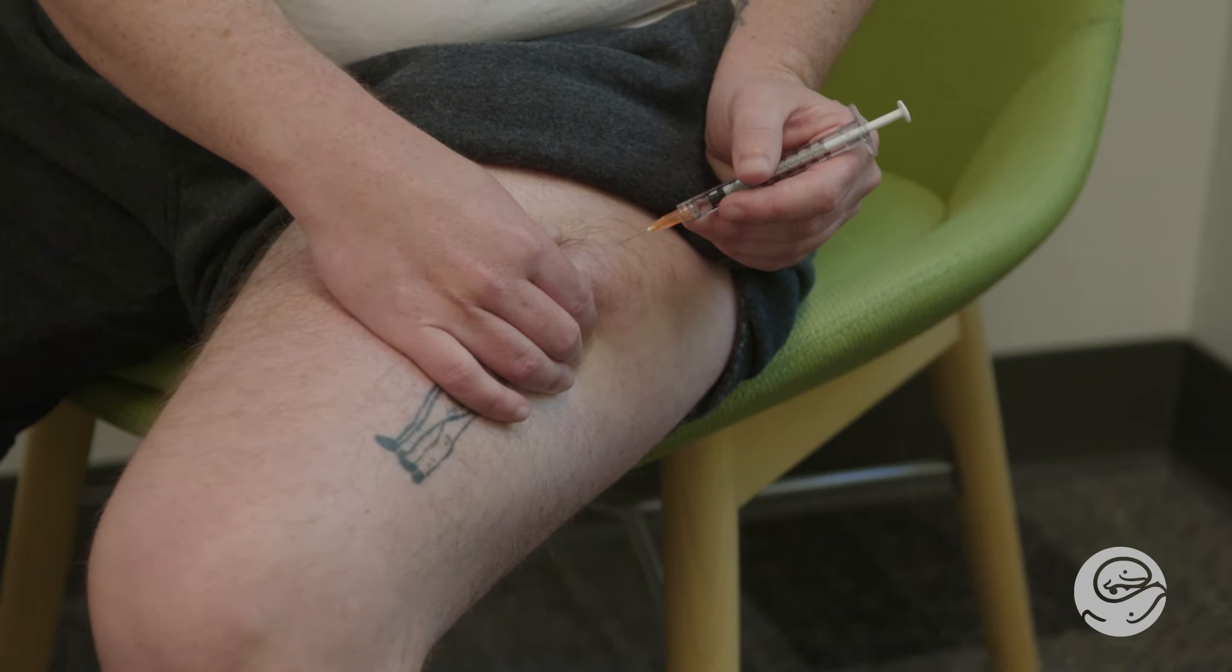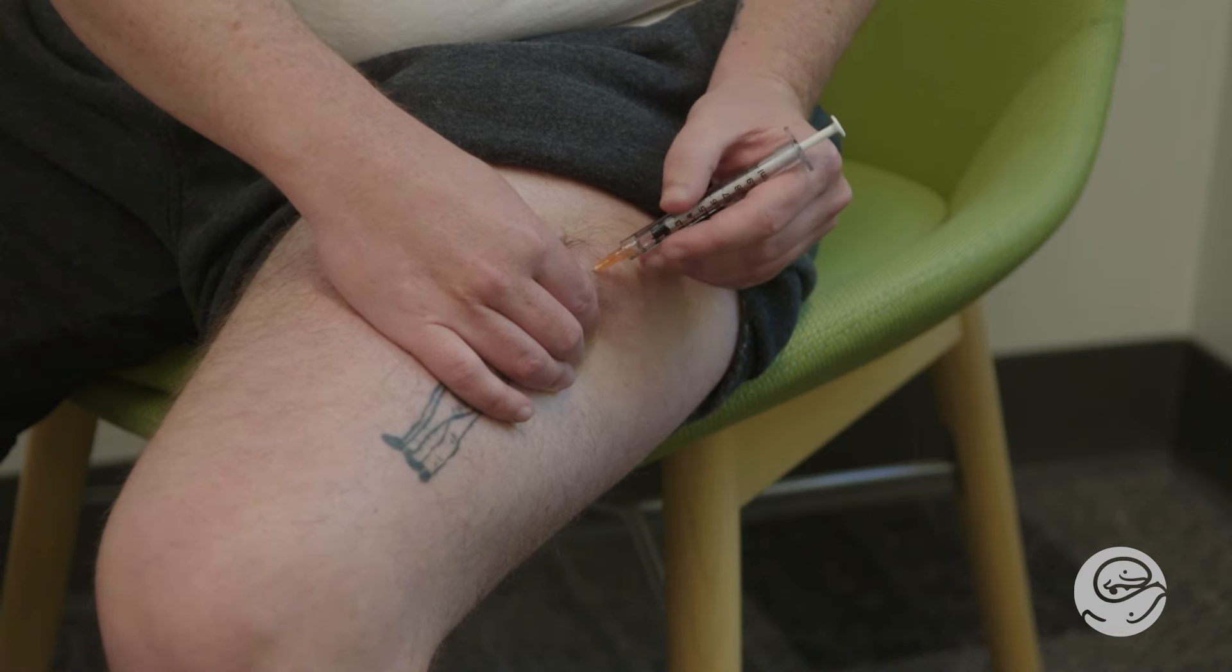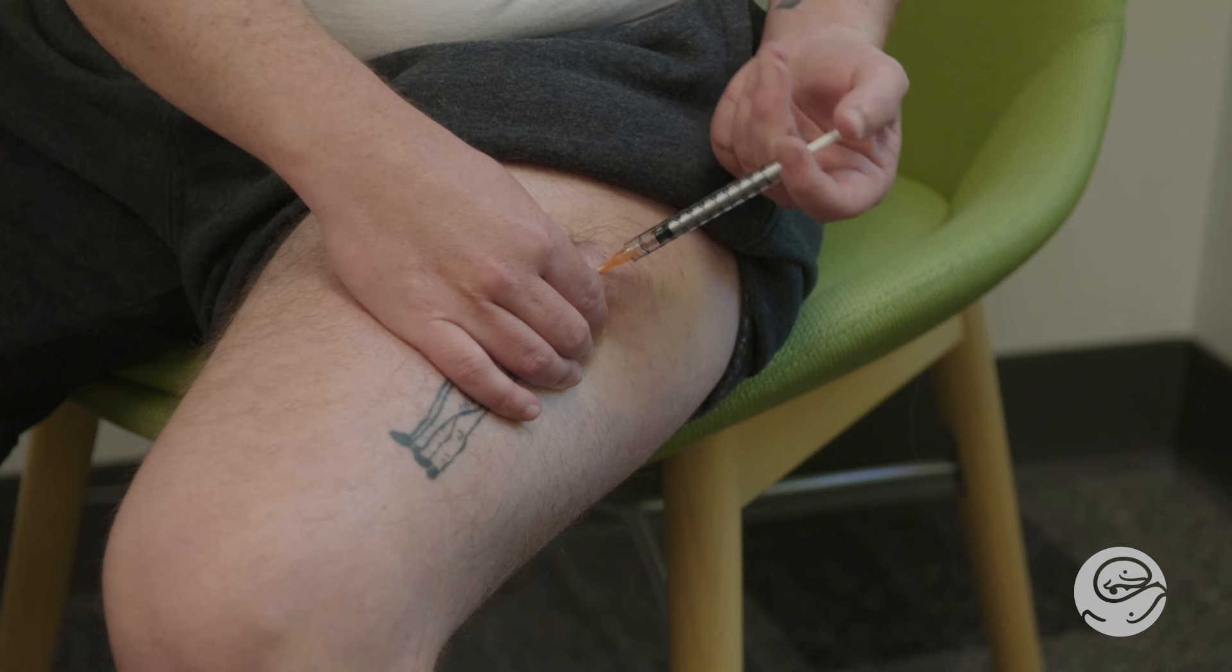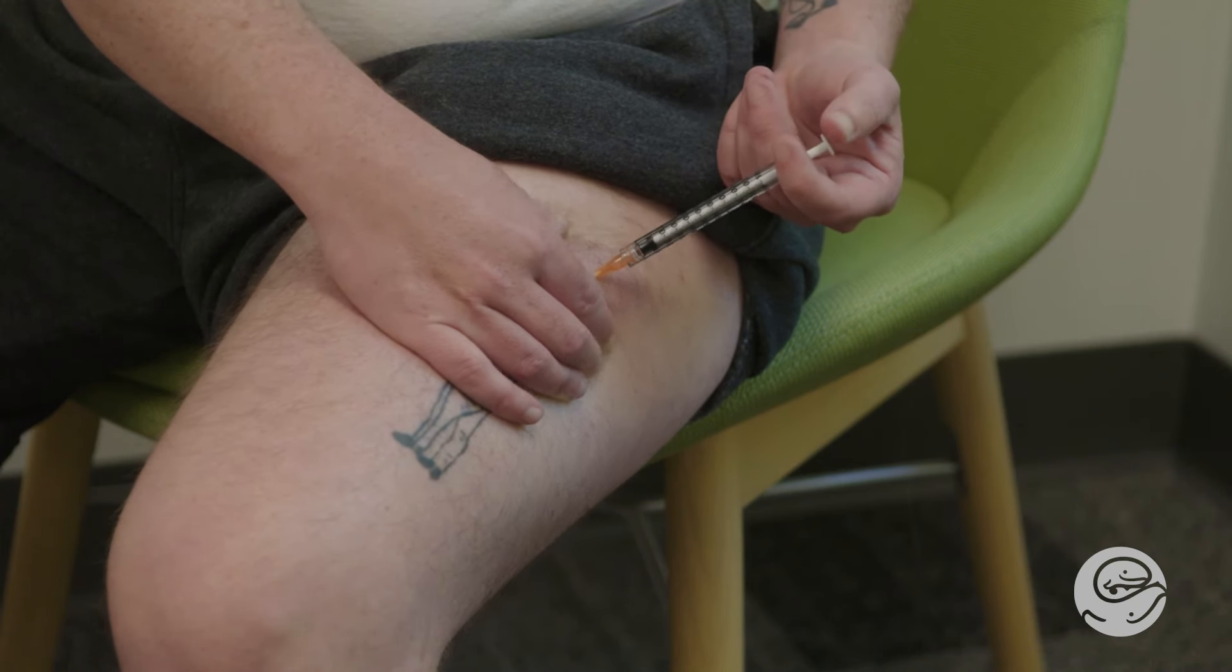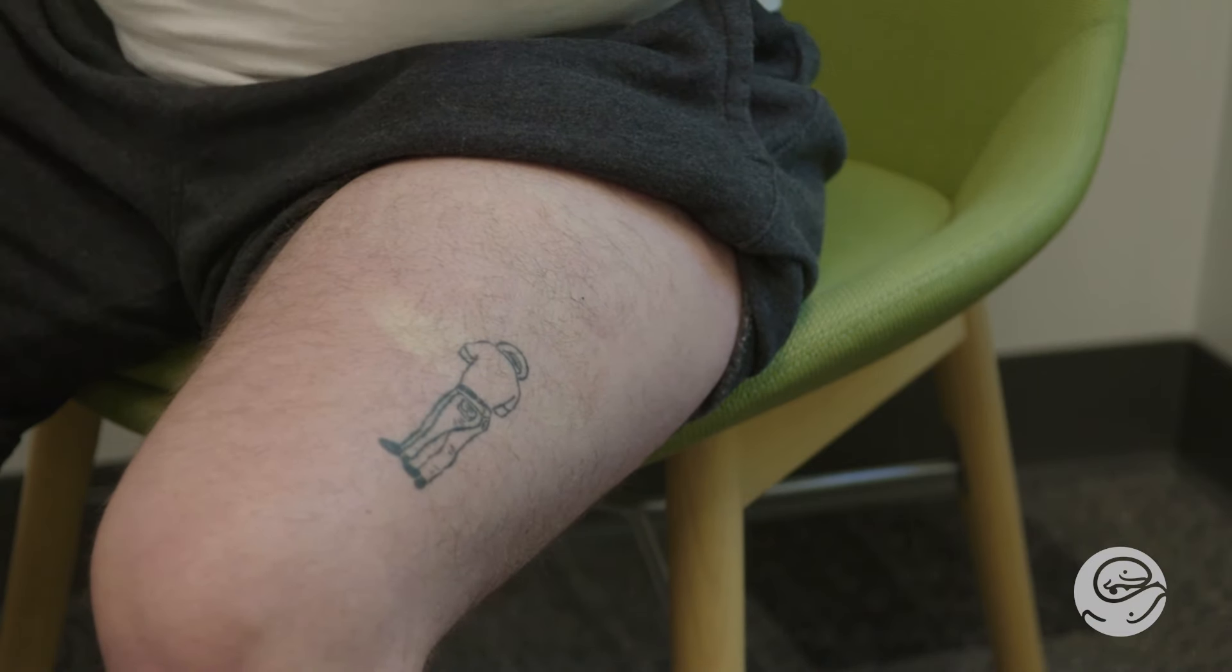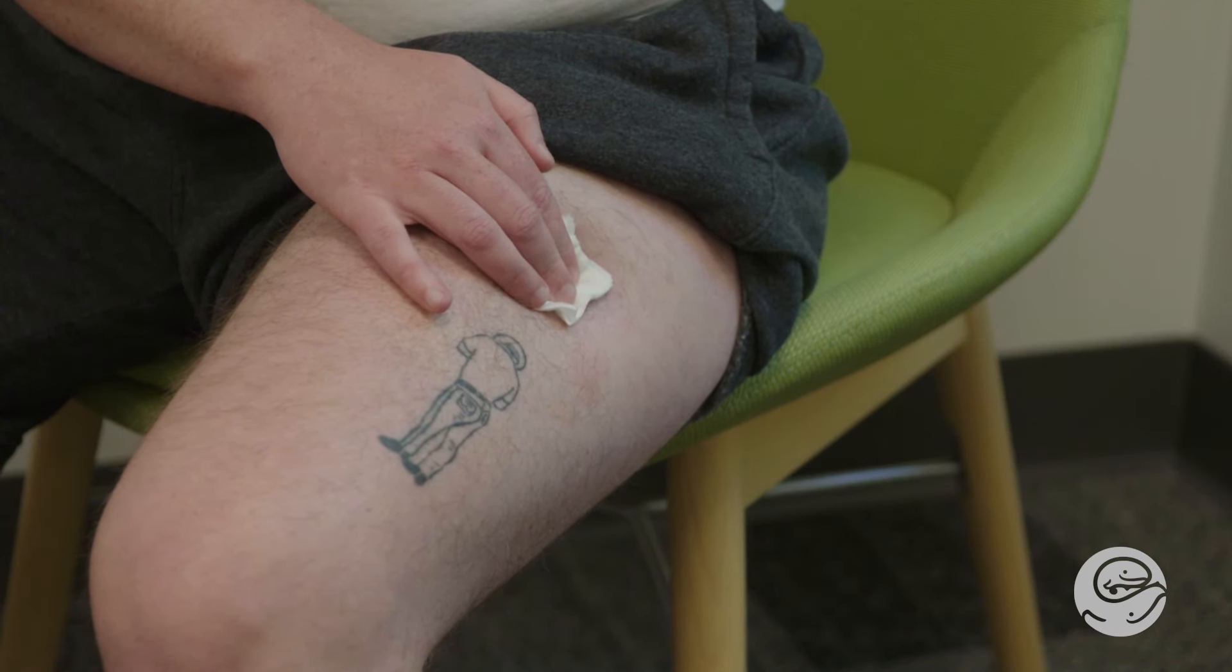Remember to breathe. You may now insert your needle fully and quickly into the skin. Then press down on the plunger to inject the full dose into your injection site. The medicine is thick, so push in at a steady pace. Once the medication is fully injected, unpinch the skin and take the needle out quickly. Apply gentle pressure with a gauze or a cotton ball for about 10 seconds.